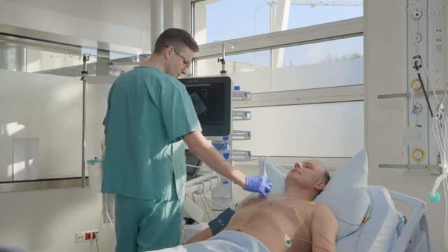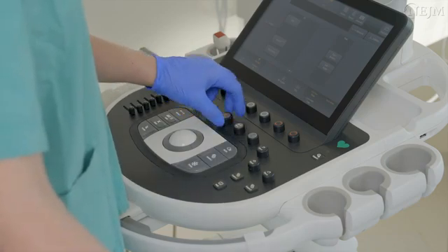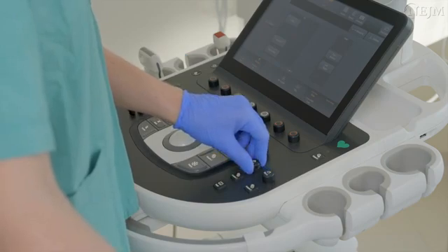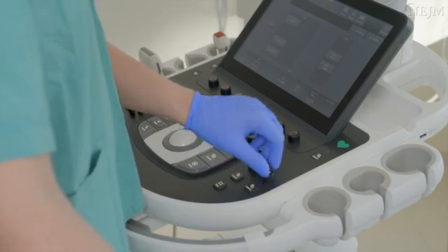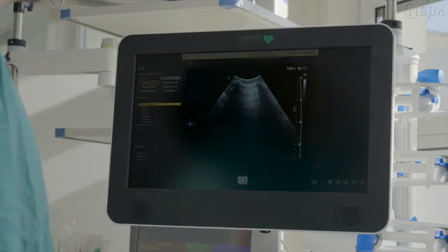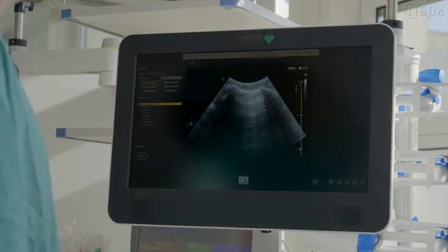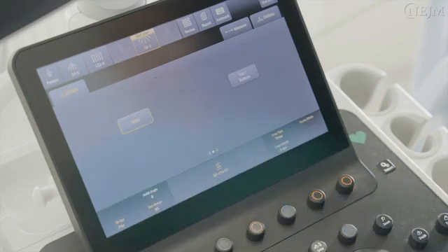Different ultrasound devices may have unique functions and buttons. If the ultrasound system has adjustable settings, adjust gain, depth, focus, and mode according to the instructions of the specific device in order to ensure a good quality image. Gain controls the brightness of the image, depth controls the field of view, and focus determines the sharpest point of the image. The B mode is selected to render a two-dimensional image, and the M mode to render a time-motion image.